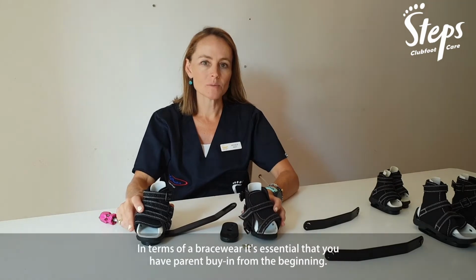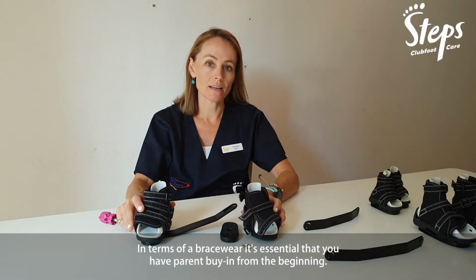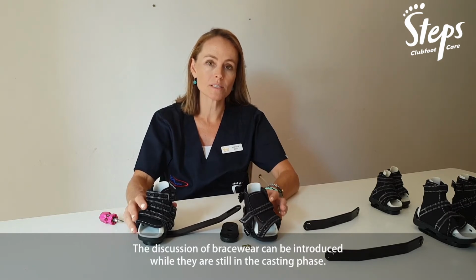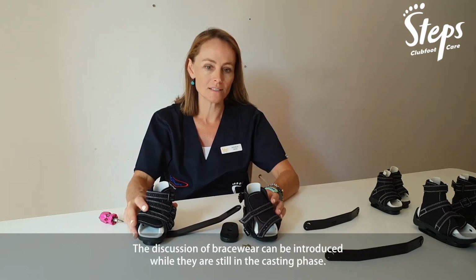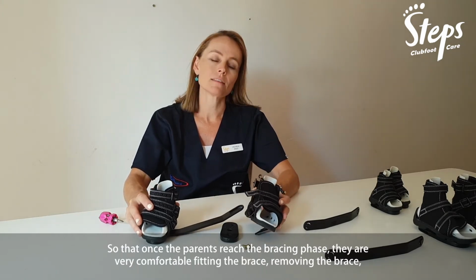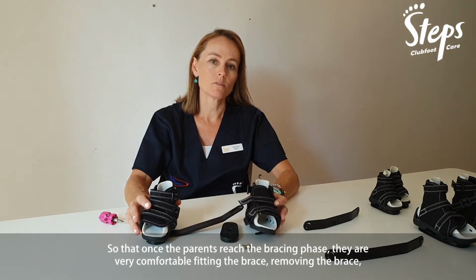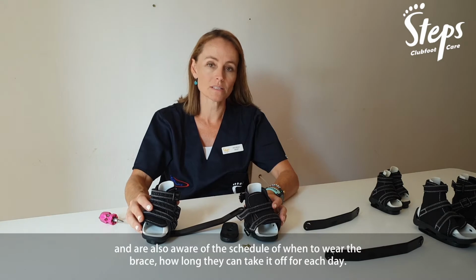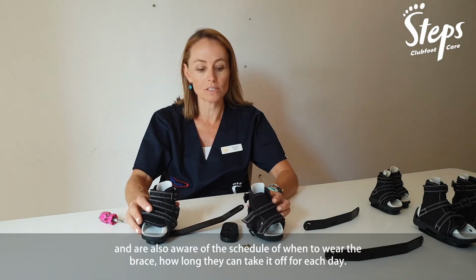In terms of brace wear, it's essential that you have parent buy-in from the beginning. The discussion around brace wear can be introduced when they are still in the casting phase, and then once the parents reach the bracing phase, they're very comfortable fitting the brace, removing the brace, and are also aware of the schedule of when to wear the brace and how long they can take it off for each day.